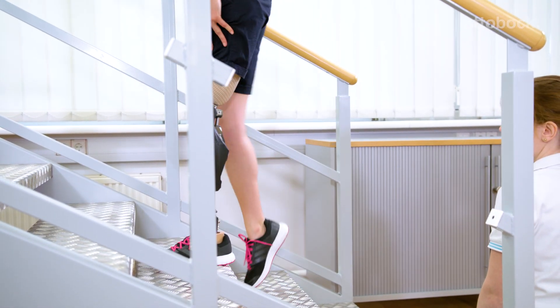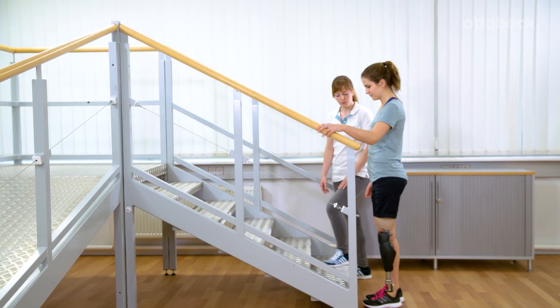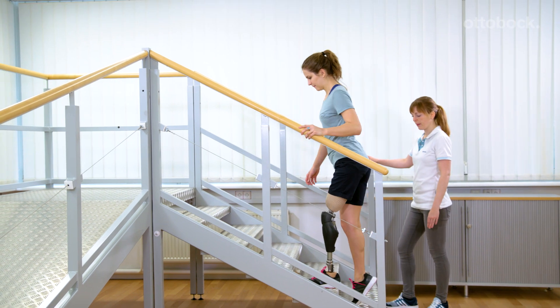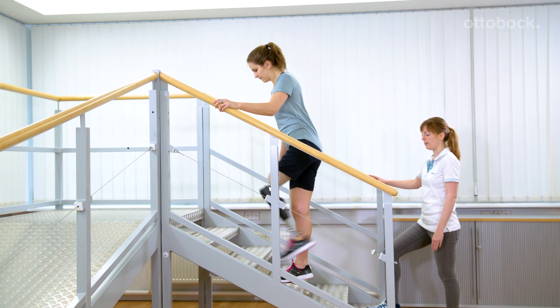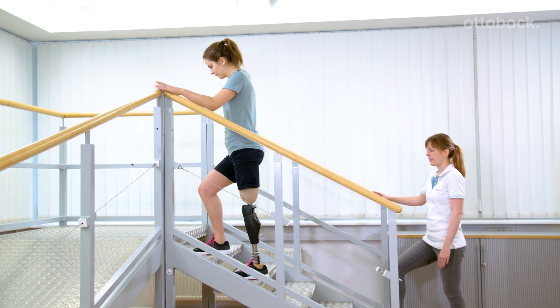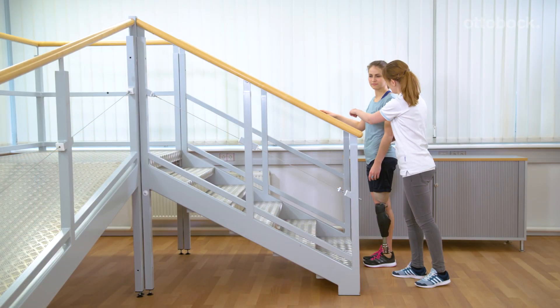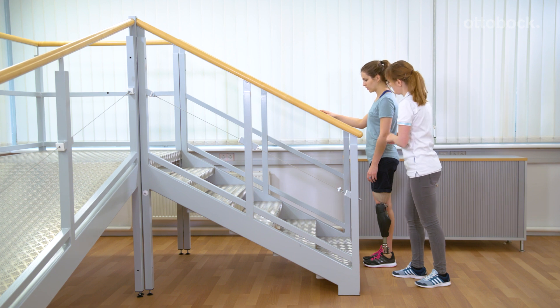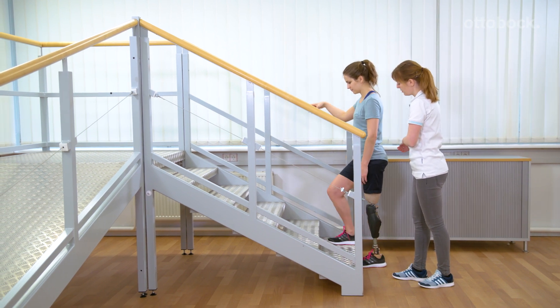The ability to utilize the stairs function can depend upon stump length, muscle power, socket fit, step height, and body height. For some Genium users, it is easier to start walking up the stairs with the contralateral leg and then trigger the stairs function.